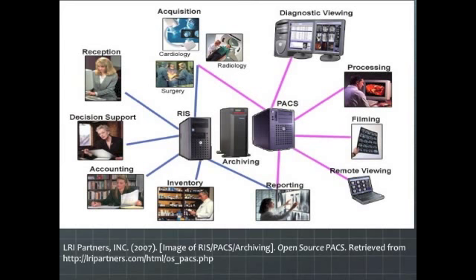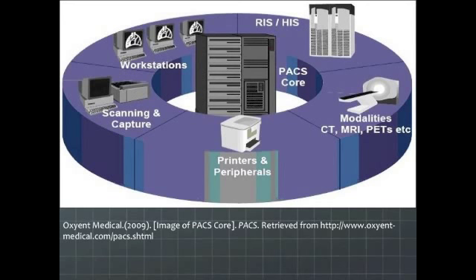If you look at it in the long haul, you're not having to have a contract for your chemicals, developer and fixer, that has to be replaced. You have a contract with the film. Film is really expensive. So in the long haul, you invest in this CR and DR imaging, one-time fee up front, but there's no maintenance required. With the invention of CR and DR, we can do a lot more imaging. You can get a patient in and out a lot quicker.